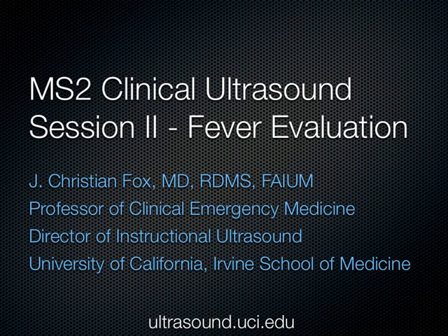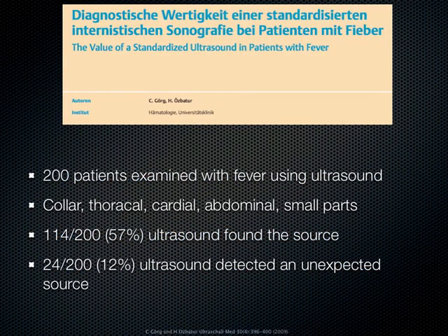This time we're going to be talking about fever evaluation, and we're trying to coordinate the curriculum in the ultrasound as close as we can with your other curriculum. Since right now you guys are focused on fevers and infections, I thought I would go through the approach to a patient who has a fever using ultrasound. And I found an article on this, and it's in German, but it's kind of interesting.